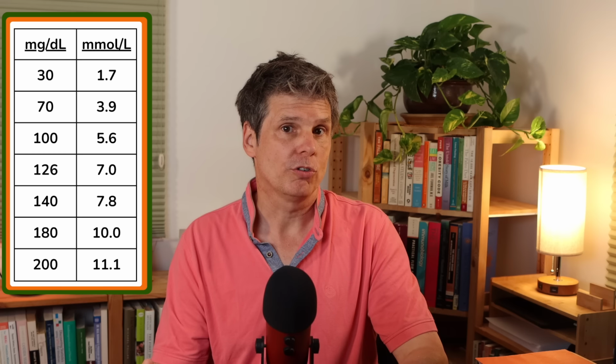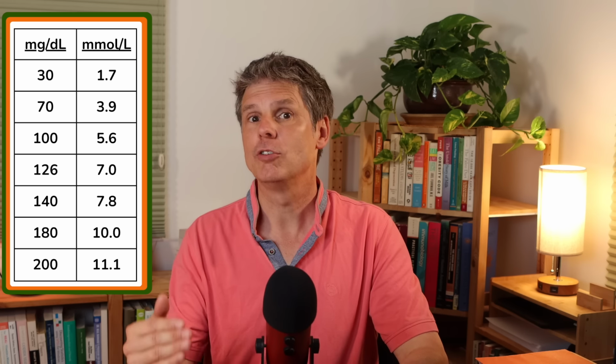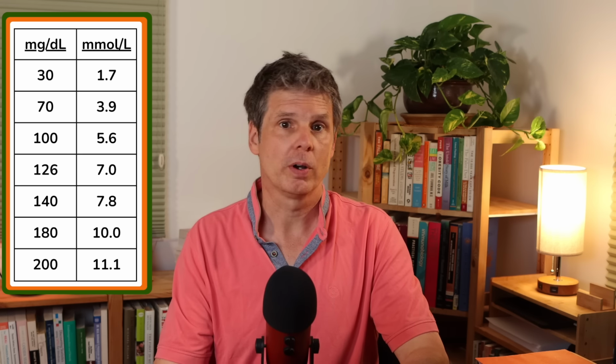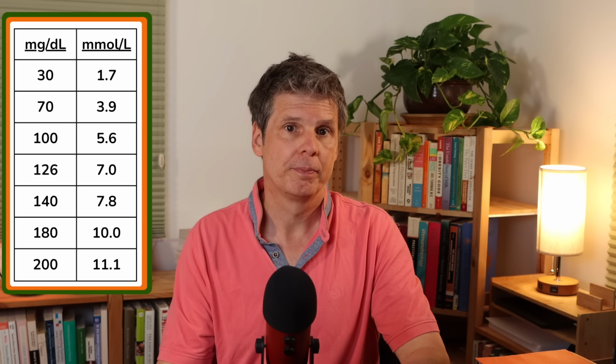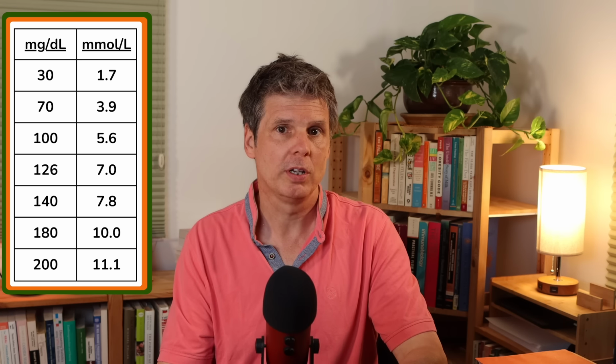And then they average how much the glucose levels rise in each of these glycemic excursions. That 30 milligram per deciliter figure, therefore, contains a lot of occasions where the sugar level rose even if no meal or even a snack was consumed. It is therefore very likely, in my opinion, that the average response to a normal mixed meal is substantially higher than that 30 milligram per deciliter figure.